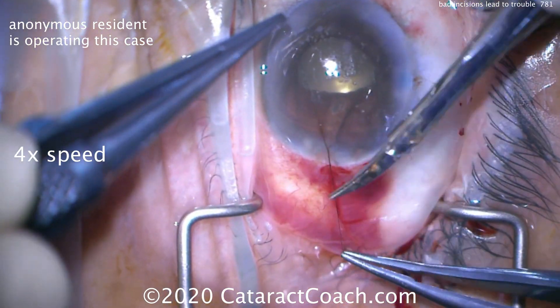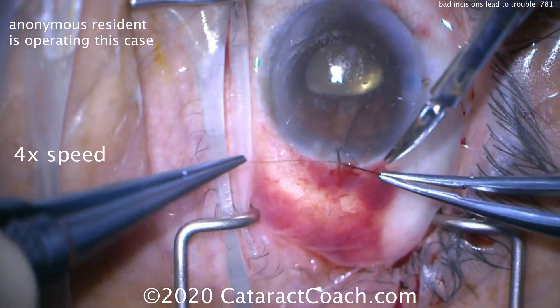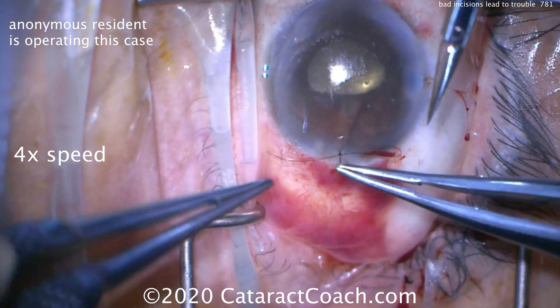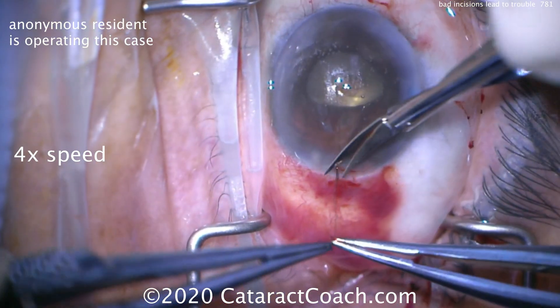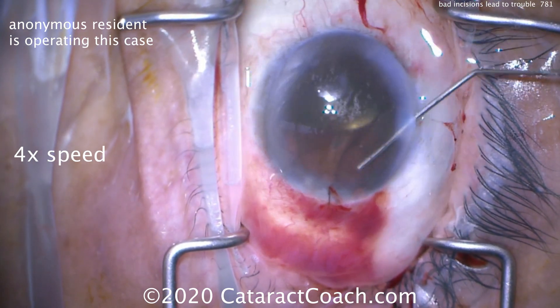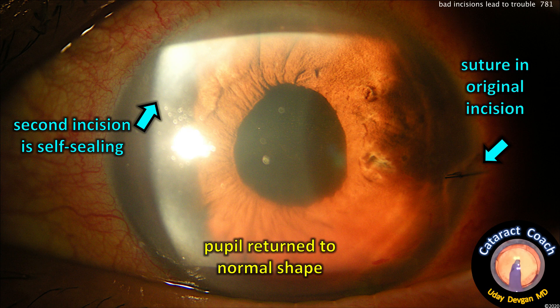But if you have to come back the day after, that's a return trip to the operating room — that's a complication. So you want to take your time, do good sutures, and if you need to, put an extra suture or replace a suture — whatever it takes. Tying this up now, it can be cut, and then it'll be rotated into the cornea. Now let's try to get an anterior chamber that's pressurized again — and now that works.